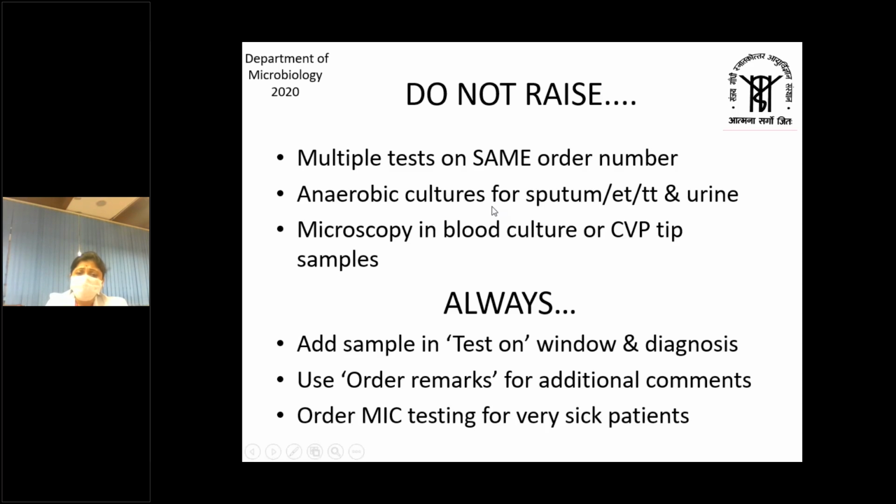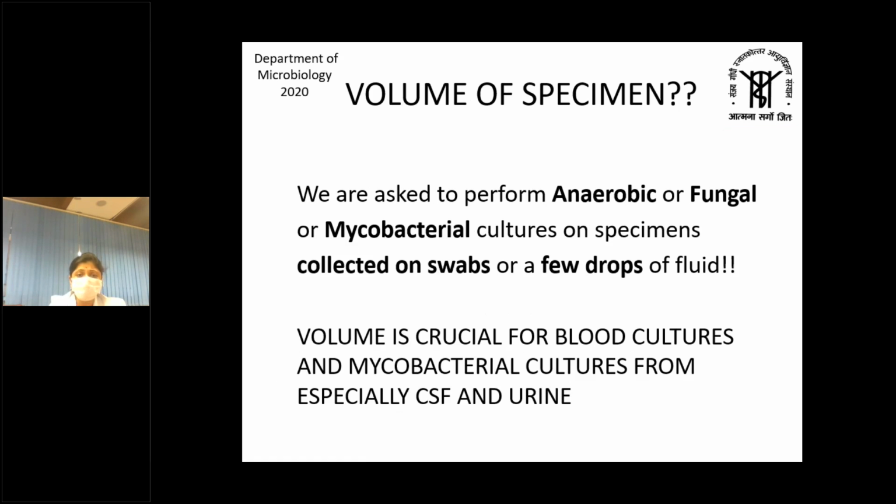Do not raise anaerobic cultures for sputum, tracheal aspirate and urine, because the rate of anaerobic bacteria causing these infections is extremely rare. Microscopy should never be raised for blood culture samples or CVP tip samples. Always remember to add the sample in the test window as well as the diagnosis of the patient. Use the order remarks section for additional comments, and if you want to opt for MIC testing, it is always good for very sick or septic patients.